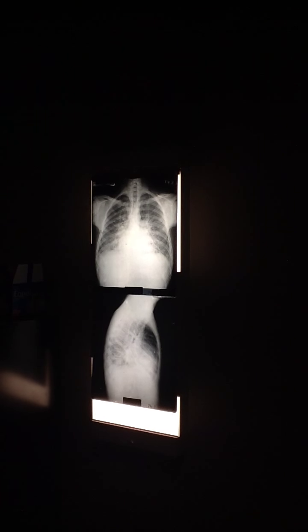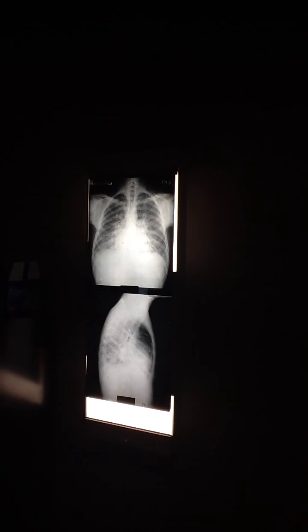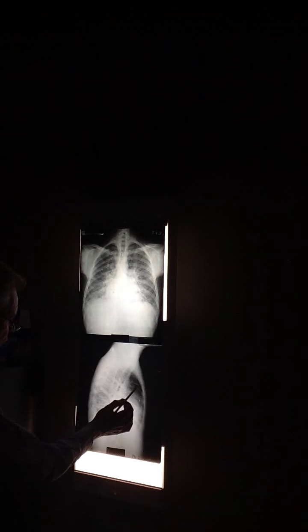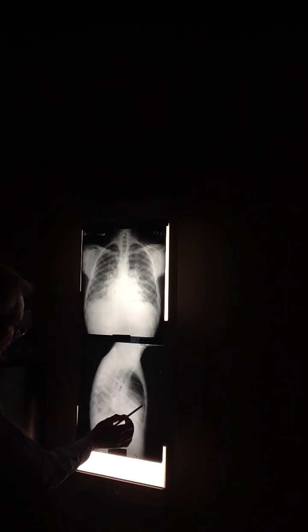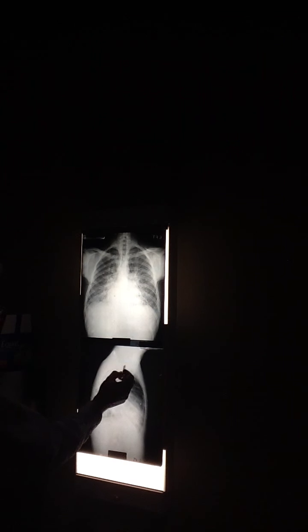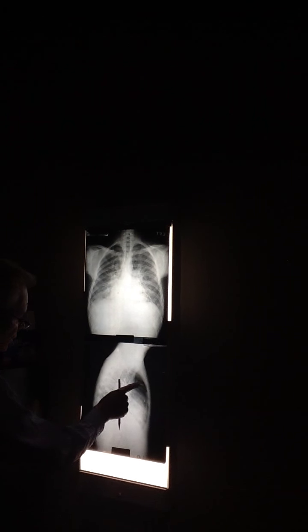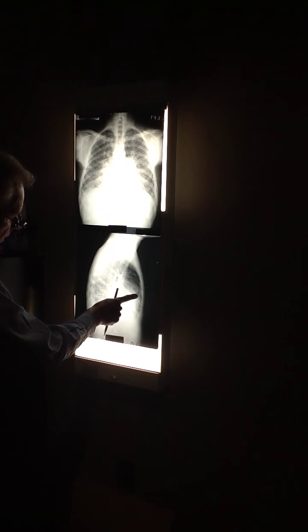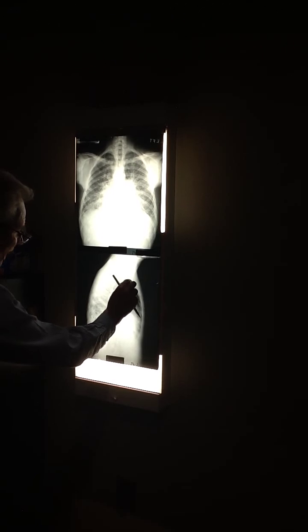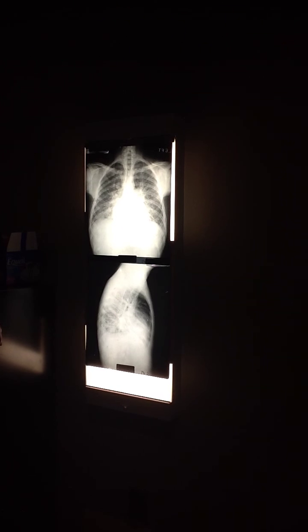But the B's are much easier to see, aren't they? Mm-hmm. This patient has really nice B lines behind the sternum here. It's all these little short lines that are perpendicular to the chest wall. As the chest wall curves, they change because they maintain this perpendicular relationship, and they're only about this long. They come out here like that. These are all curly B lines. Behind the sternum is one of the easy places to see them.